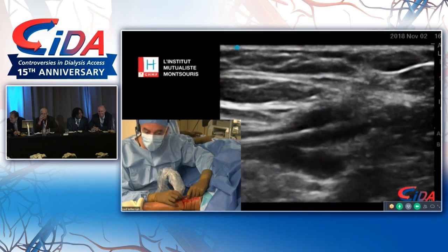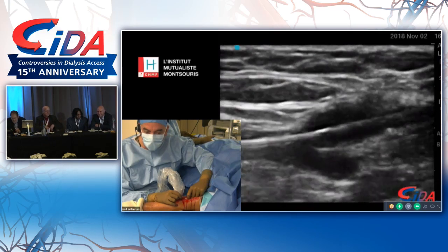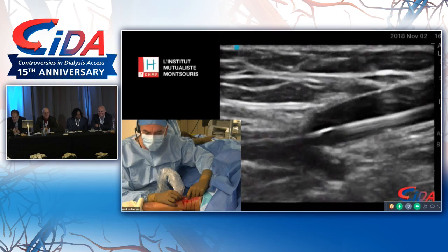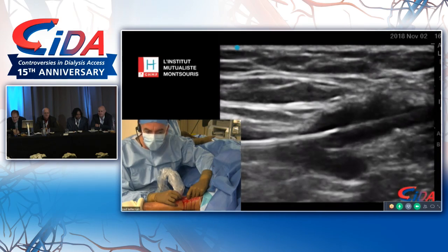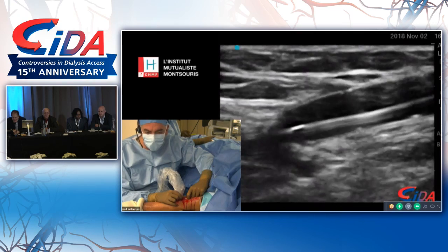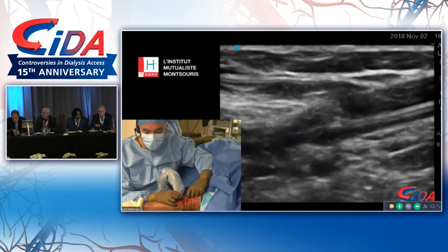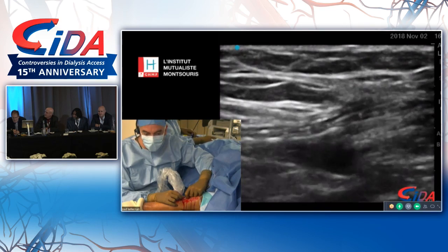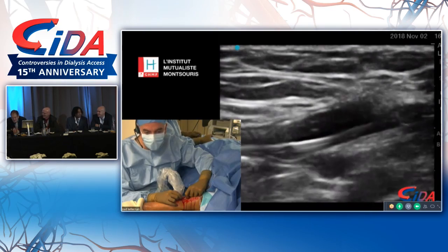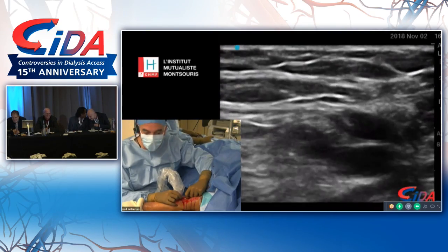So I do not. I know that my colleague Dr. Hall in particular gives a cocktail, but I do not. I don't have this habit, even when I do my open cases. So if I have spasm, I will just give it some time to recover. We give patients some red Bordeaux, take care of everything.